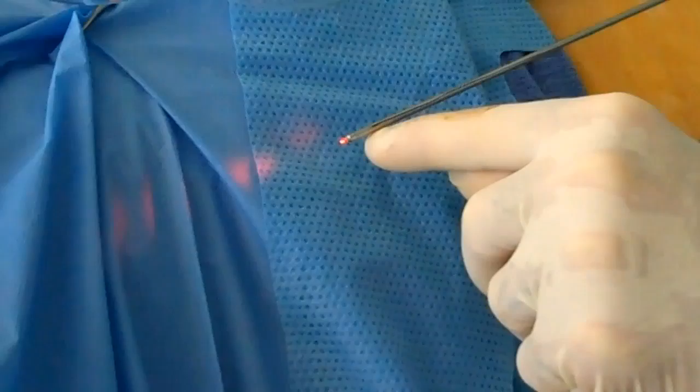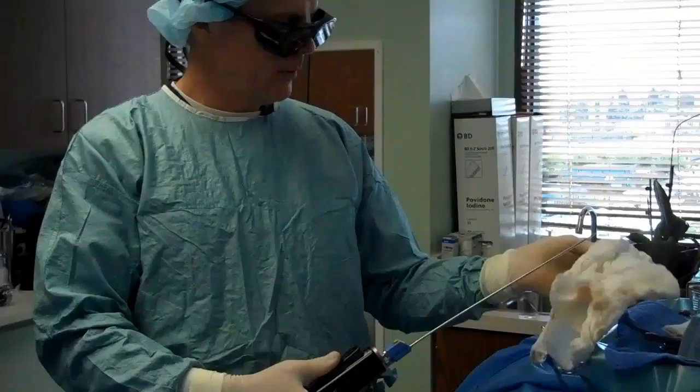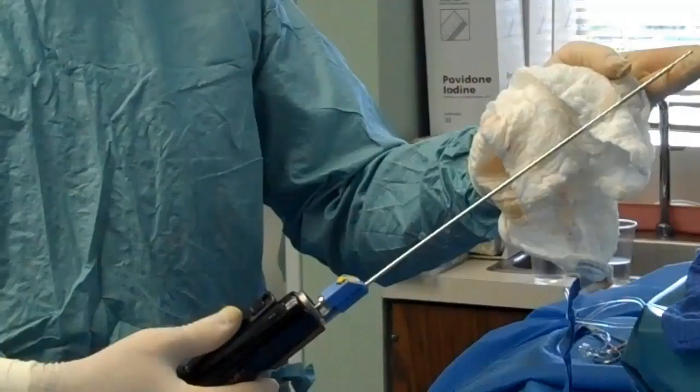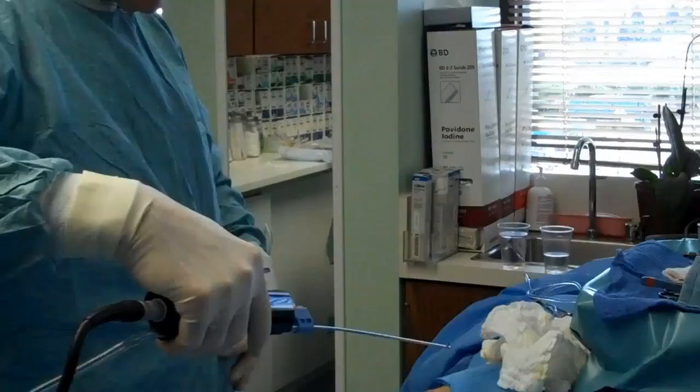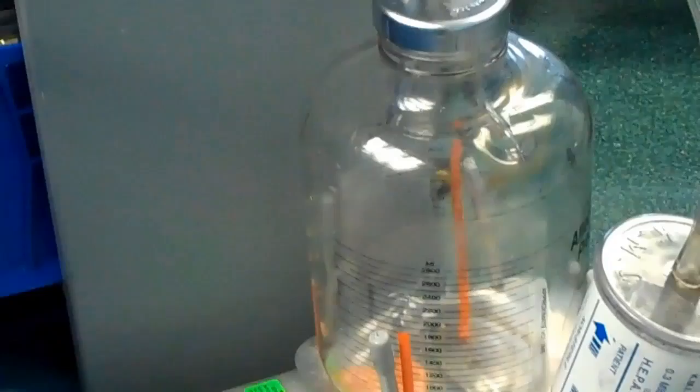This is the liposuction part — power-assisted liposuction. It's a motorized handpiece. Watch the end here when I turn it on — see how fast that vibrates. That helps to break up the fat, and we're going to remove all the fat that we just melted. With regular liposuction, the fat that comes out is much more reddish; the laser really helps.